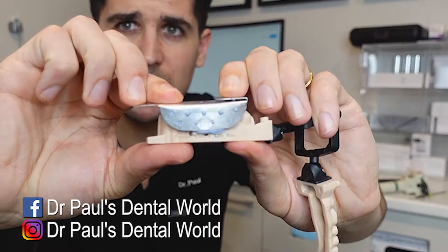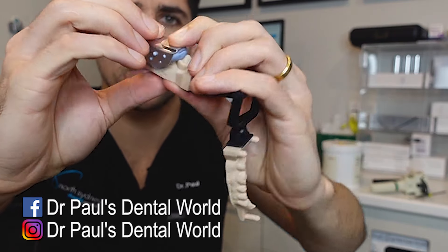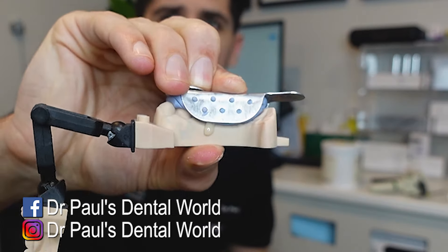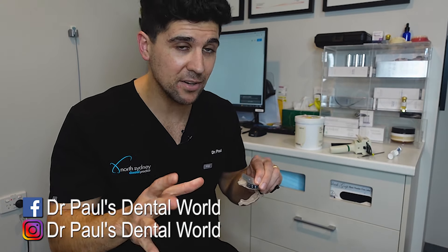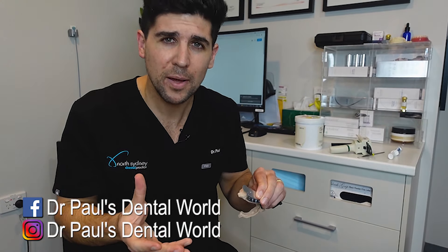You should be able to see that we've got excess there on the buckle, excess there on the palatal. I'm just going to keep some pressure on that and hold it in place for about... This is Luxor Temp. I do it for about 35 seconds.